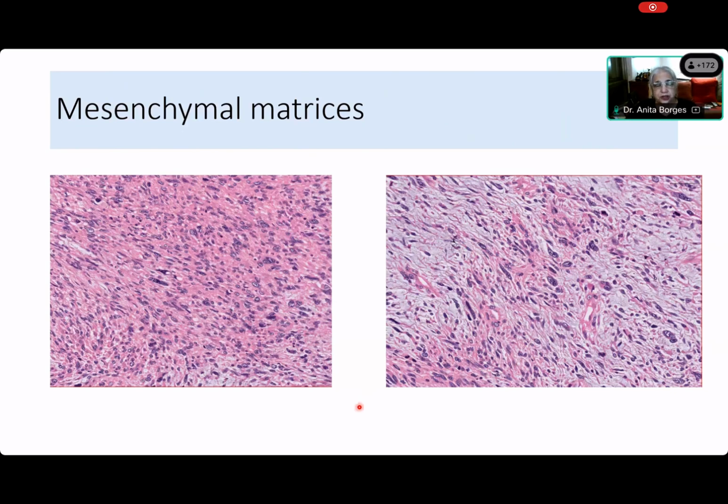Saida, it is extracellular. It's inside a lumen. It is a material. It is not cellular. So what is it? Deepali, what would we call it? Stroma. No, if it's inside a lumen, what do we call it? We call it a secretion, right? So when I have any, whether it's a gland or a duct, and there is a secretion inside of it, is that extracellular or not? Yes, a lumen is extracellular.